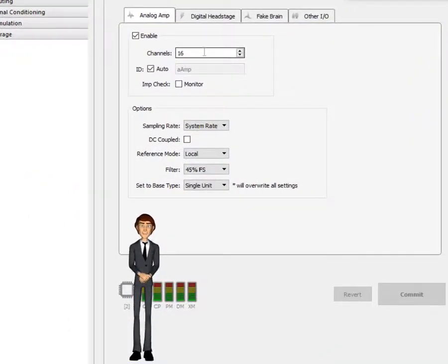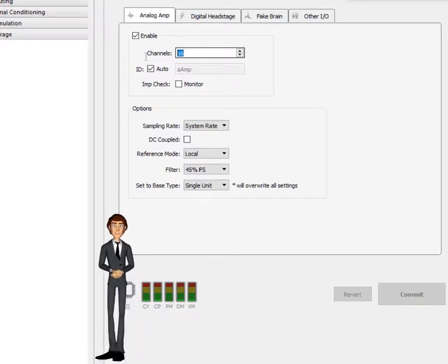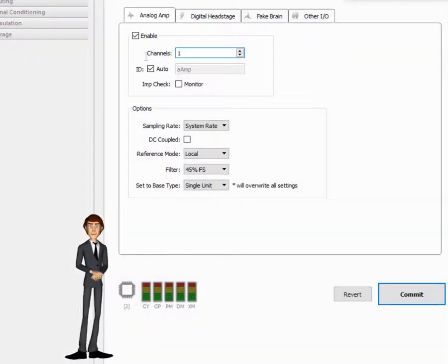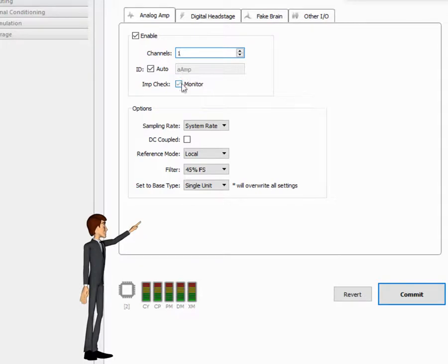Now we'll adjust a few settings. We need just one channel. Also click the impedance monitor on, so we can check how well we did with the electrode application. Then select EMG from this list, and the LabRat amplifier will be configured with appropriate settings for EMG signals. Click the commit button to apply these changes.